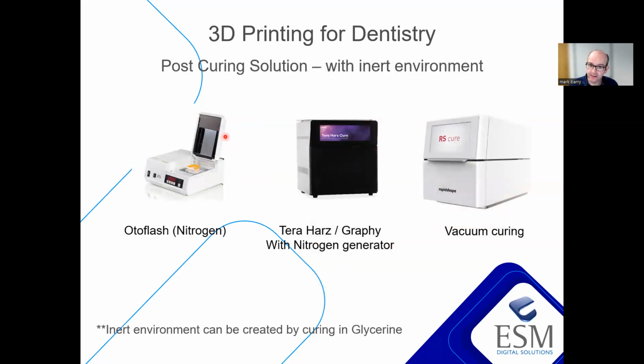And then we've got some, let's take curing to, I'm going to say to another level, but yes, it is, we are taking these curing units to another level. I suppose the idea here is we're removing oxygen. And the idea is that we're going to do the curing in an inert environment. And how do we create that inert environment?